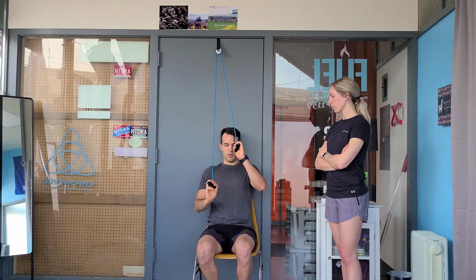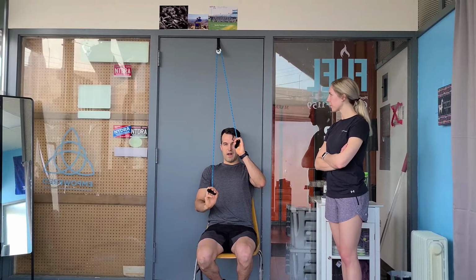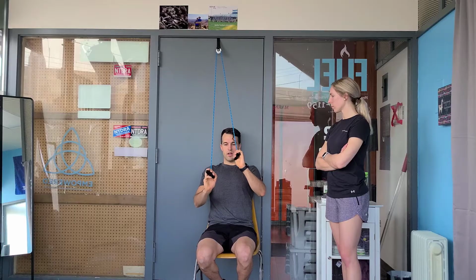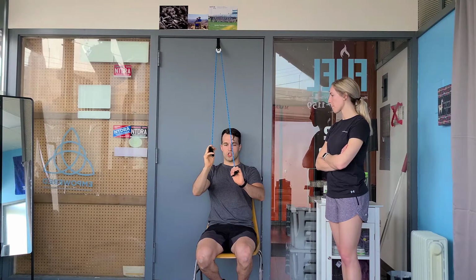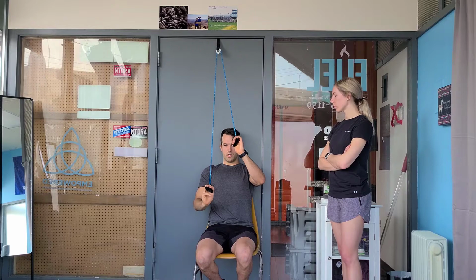I'm going to change where the chair is. Have the chair right against the door. Hold for about 5 seconds is what I recommend. And then I lower it nice and easy down. And I like to just slowly work into that range of motion.